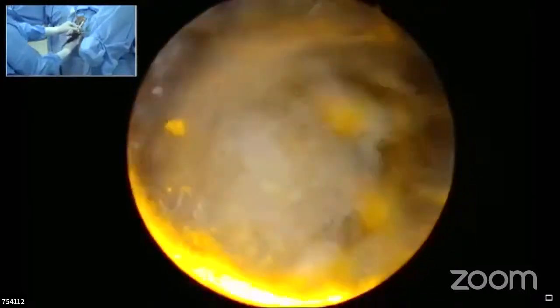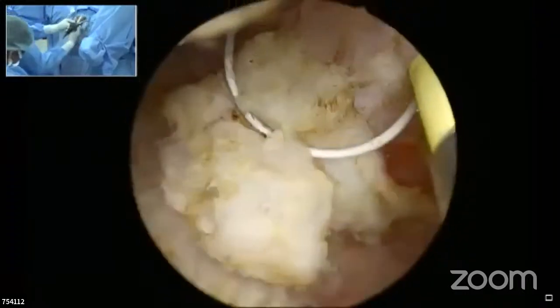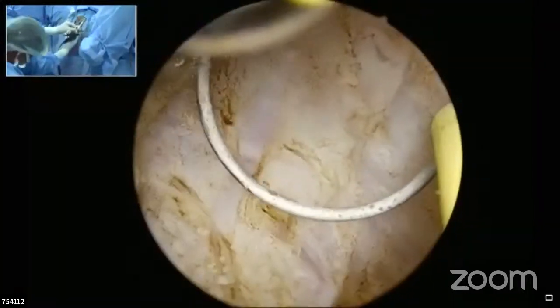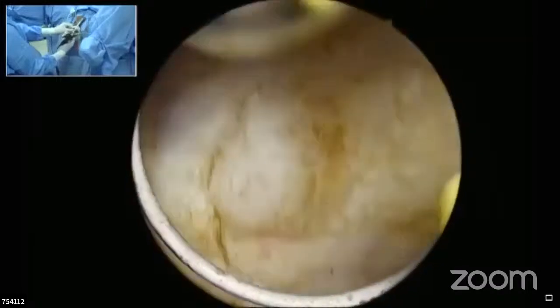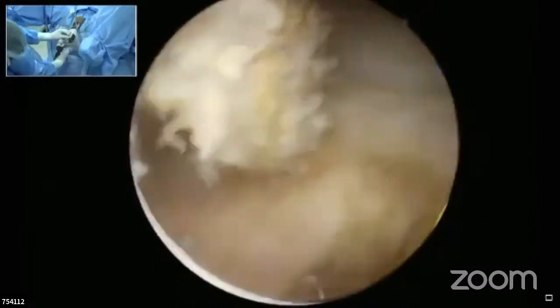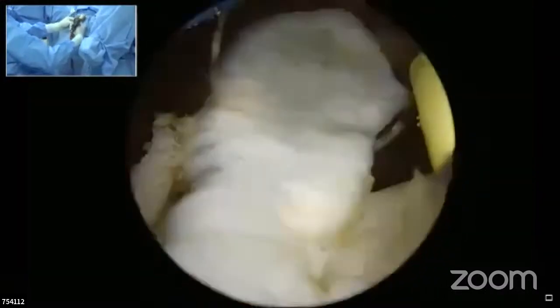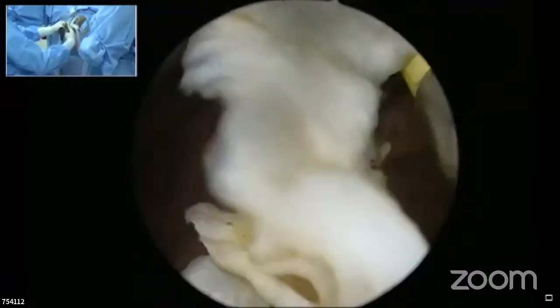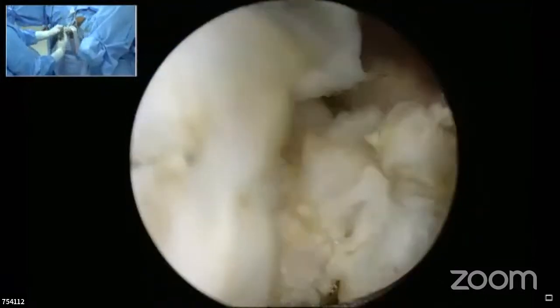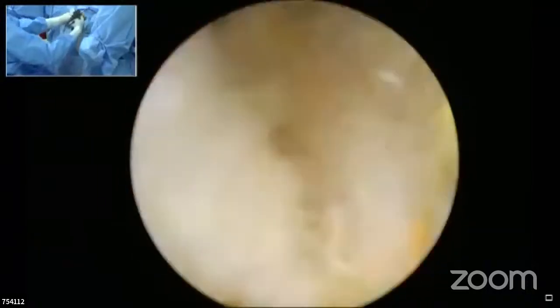When you reach the capsule, you take small chips. When you are on the surface, you can take them extended. The speed and the aggression of the resection can be higher at the start of debulking the adenoma. And once we have debulked most of it and we are closer to the capsule, we need to taper down the depth of the chips. As the classic teaching goes, the shallower the chips, the closer to the capsule.